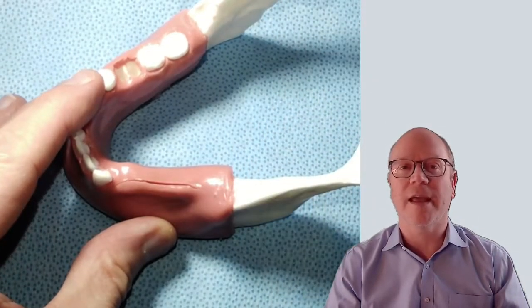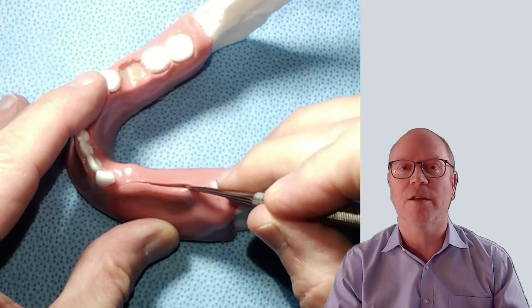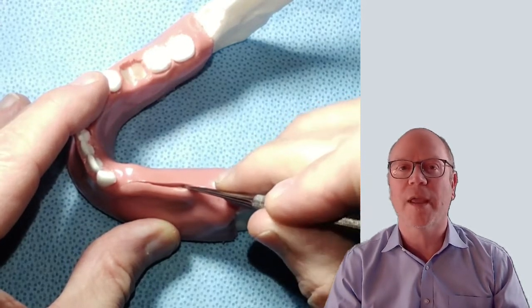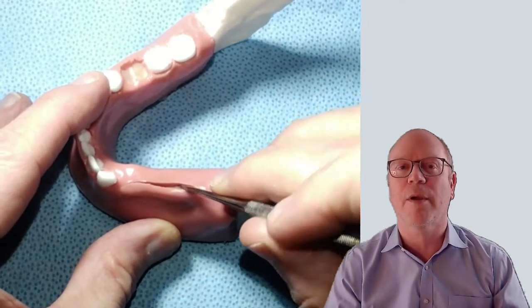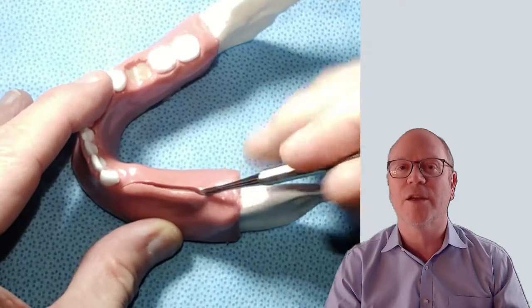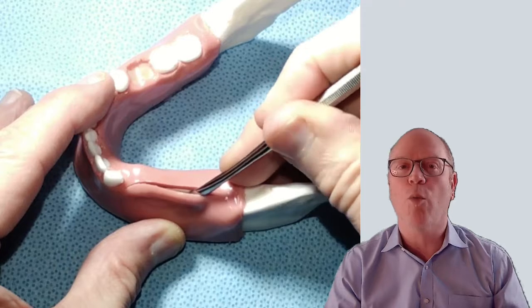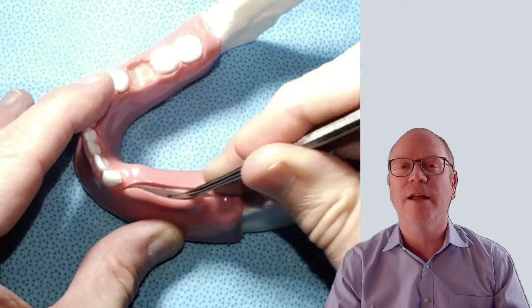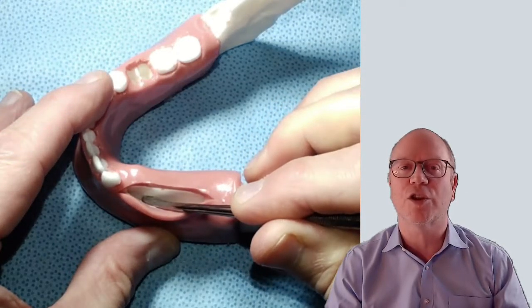When doing the flap, the scalpel goes right to the bone. You take that sharp end of the periosteal elevator and go right to the bone to get started elevating the periosteum. Trace out your incision, then flip it over to the wider side and walk it up and down the incision line to lift the periosteum, going deeper and deeper.